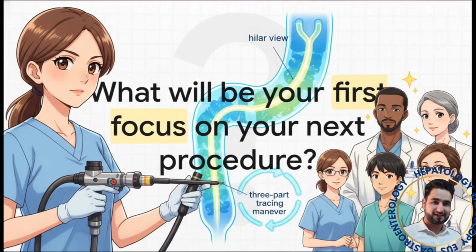So as we finish up, I want to leave you with a question to think about. On your very next procedure, what is going to be your number one most deliberate focus point? Is it going to be getting that perfect view at the hilum, or maybe executing that smooth three-part tracing maneuver? I guarantee adopting this kind of structured approach is going to build your confidence and your success rate.